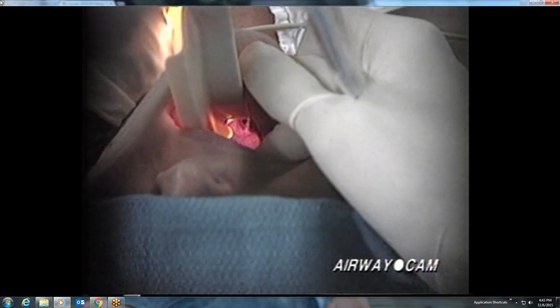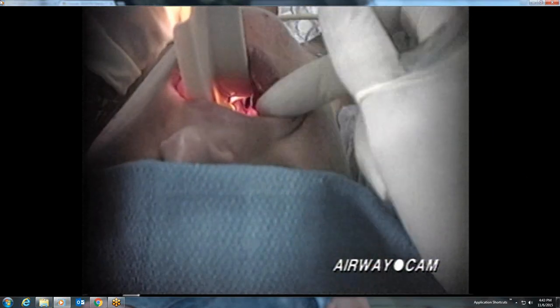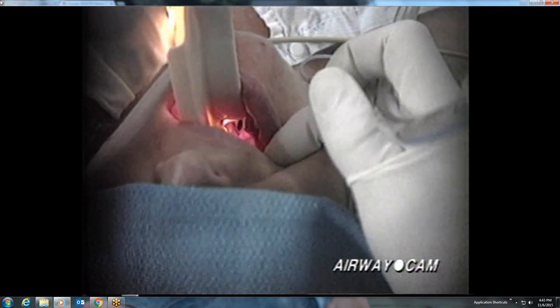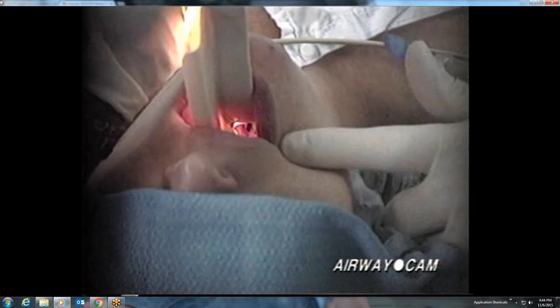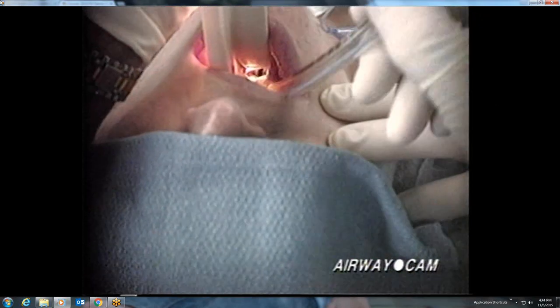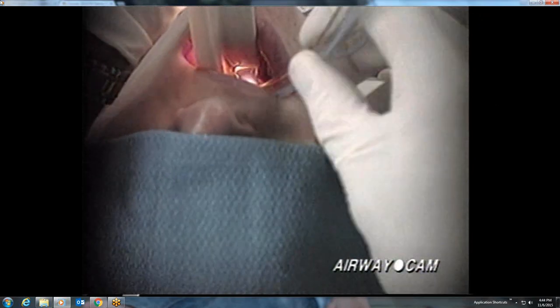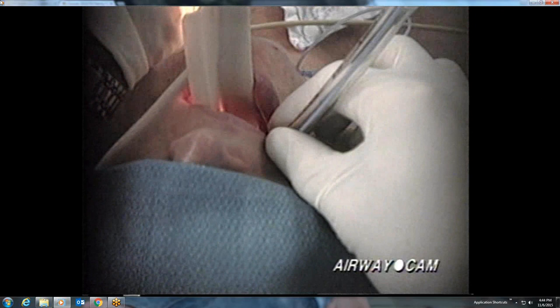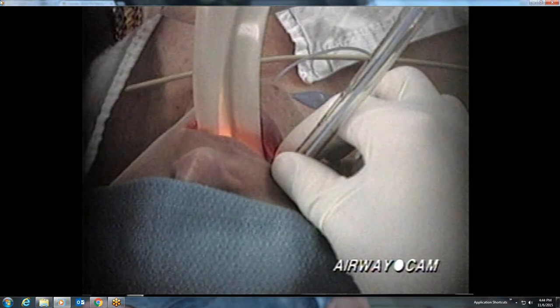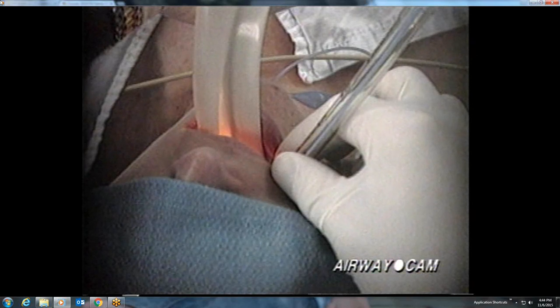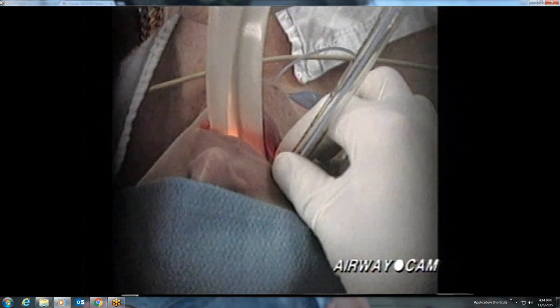Pressure on the hyoepiglottic ligament at the vallecula causes the epiglottis to flip upwards, revealing a nice view of the larynx. The endotracheal tube is carefully guided down the right side of the mouth into the glottic opening, and the tube is stabilized at the lip line. The tube should be inserted to 21 centimeters at the incisors in women and 23 centimeters for men.